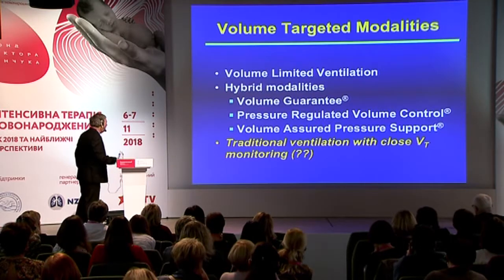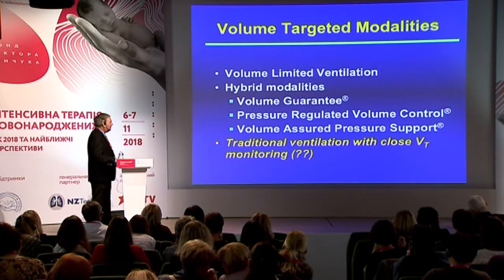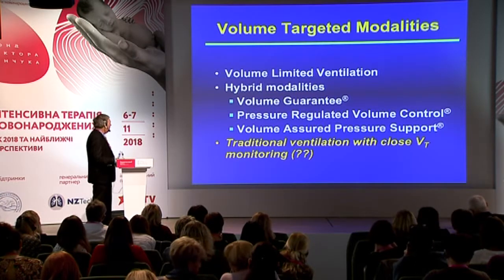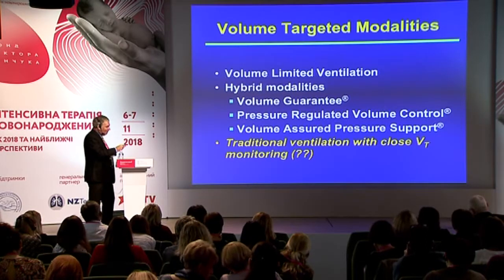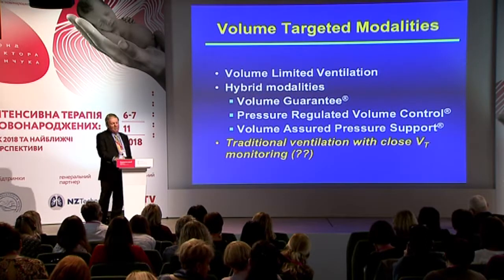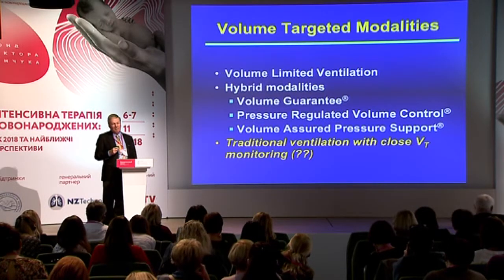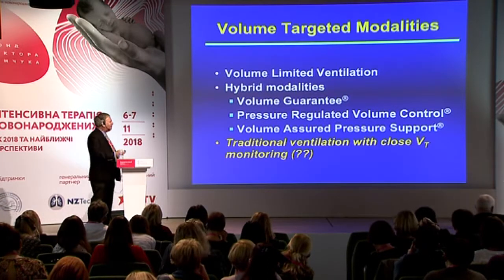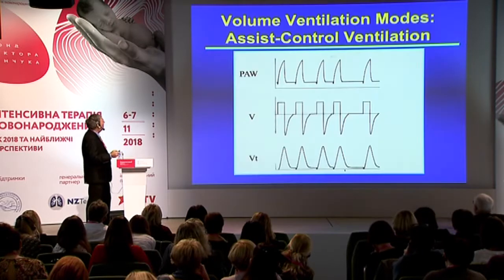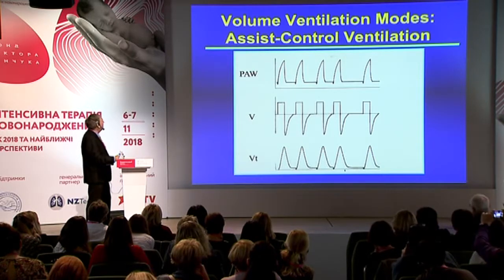And finally, I'm often asked, well, we don't have a volume device. Can we do this by just closely monitoring the tidal volume delivery? And the answer is maybe, but I would guess that you're not quite as fast nor quite as accurate as the computer. And you should be doing that anyway, no matter what type of ventilator you're using. And this just shows you, again, the waveforms with assist control ventilation.